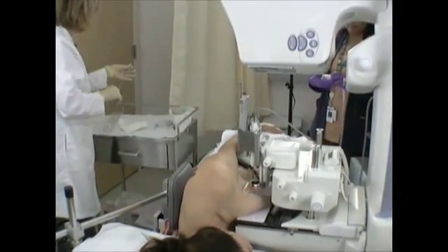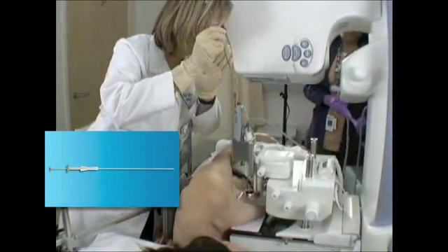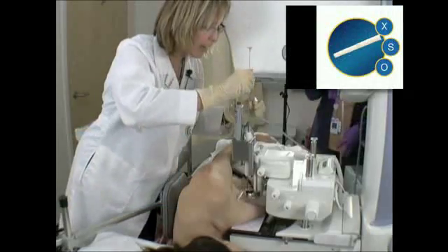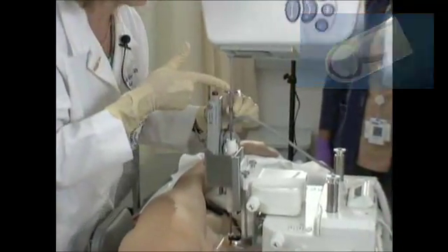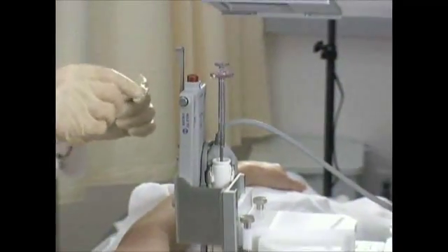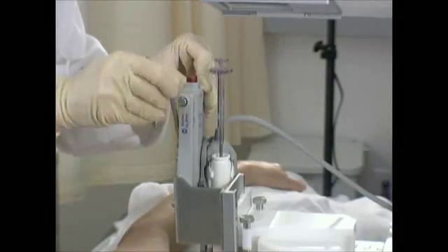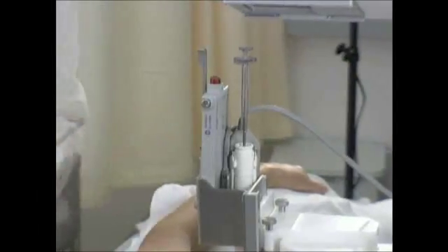It's quite simple to introduce the tissue marker into the breast, though it does require a steady hand. The important part is to make sure that the yellow arrow lines up with the red arrow on the device so that the tissue marker goes out of the sample notch and not back into the needle. I plunge the tissue marker out, rotate the needle 180 degrees, and we take a stereo picture to confirm the tissue marker went out. The tissue marker is in the breast, which is where we want it.